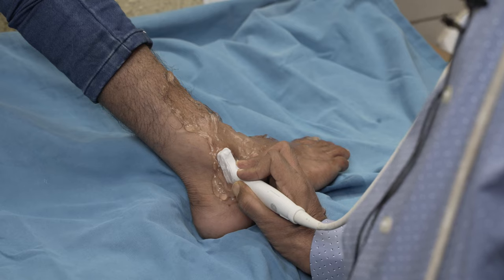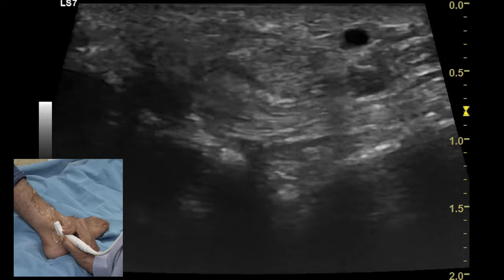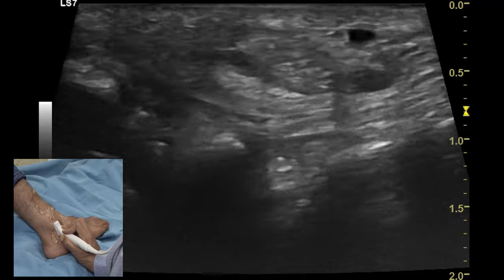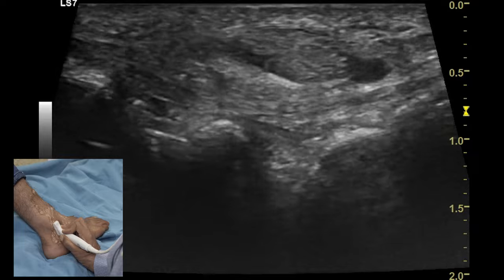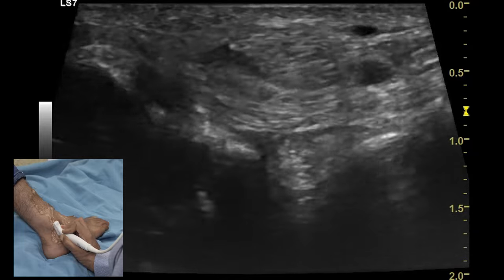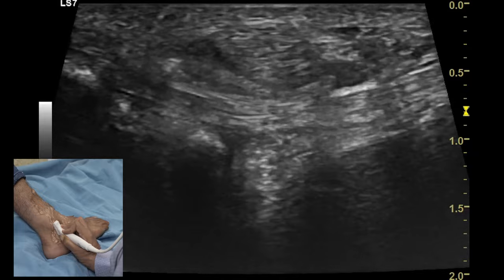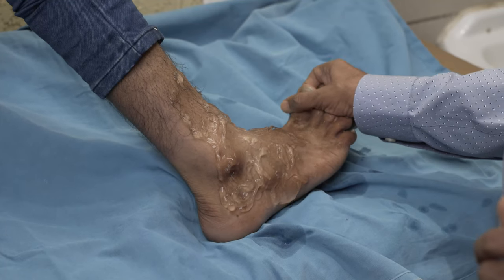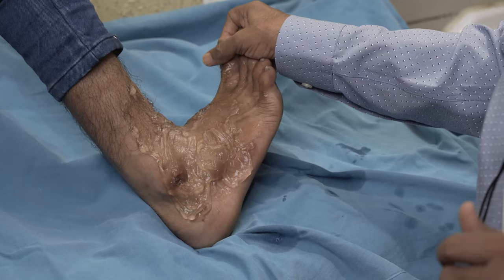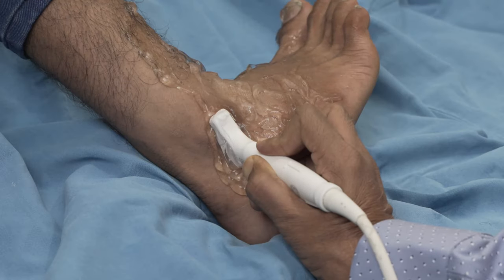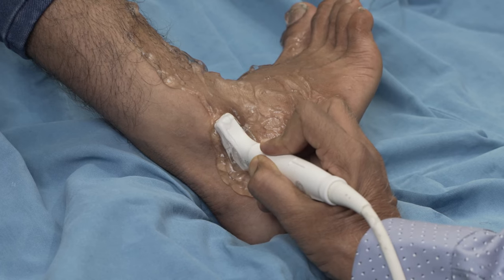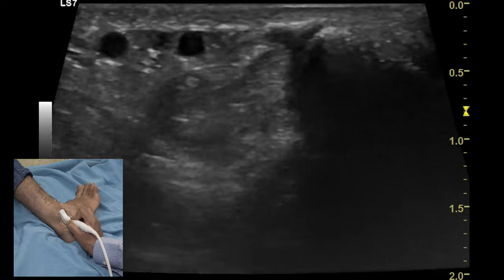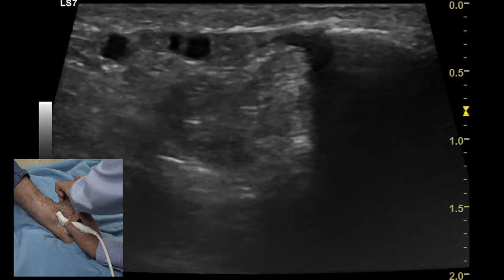The third ligament on the lateral aspect of the ankle evaluated is the calcaneofibular ligament. By connecting the lateral malleolus and the calcaneum one can visualize this ligament. However, because of the obliquity of the ligament in the neutral position, there is significant anisotropy, and diagnostic dilemma always persists. To visualize it more clearly, there is a need to perform dorsiflexion of the ankle by asking the patient to lift the foot above the examination bed. After achieving dorsiflexion and connecting the lateral malleolus and the body of the calcaneum, one can visualize the calcaneofibular ligament very well as a hyperechoic structure.